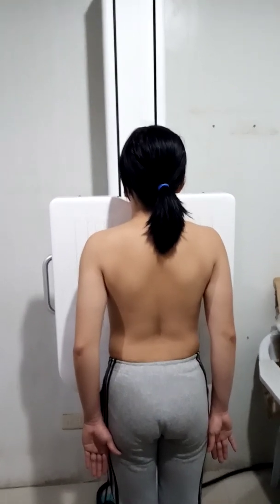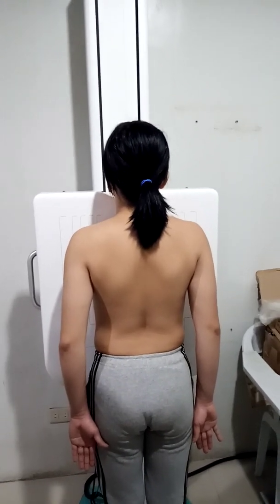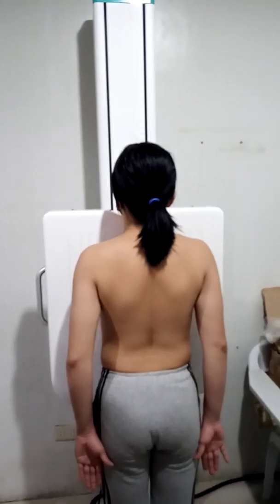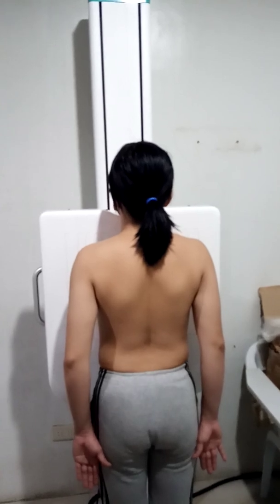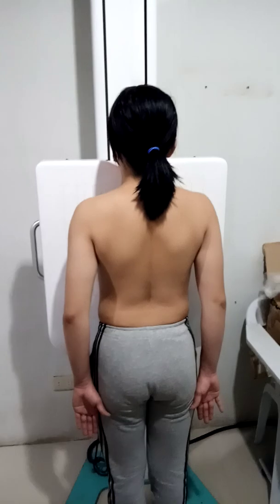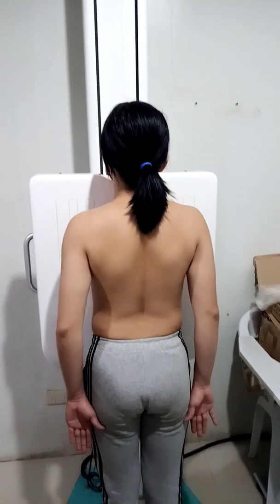Next one is the respiration. Before exposing the patient, make sure that you instruct the patient to suspend his or her breathing. It's full inspiration to depress the diaphragm. The next one is the SID that we're going to use, which is 72 inches.